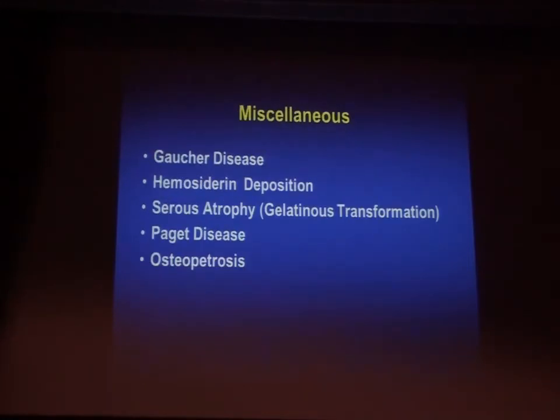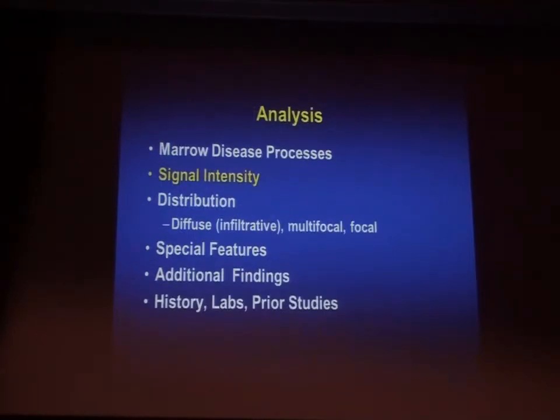And then there are some processes that affect the marrow that don't fit into any of those categories, and these are some of the things that come in there. And we can talk about those individually.